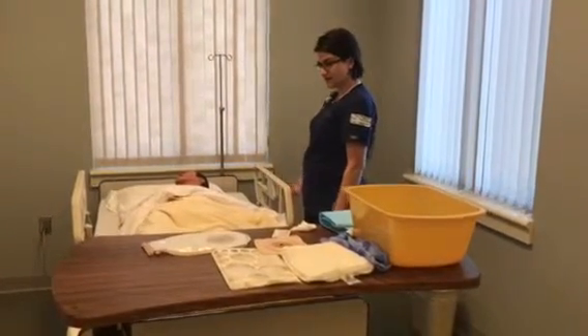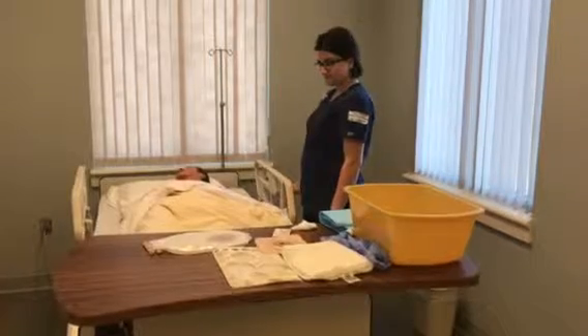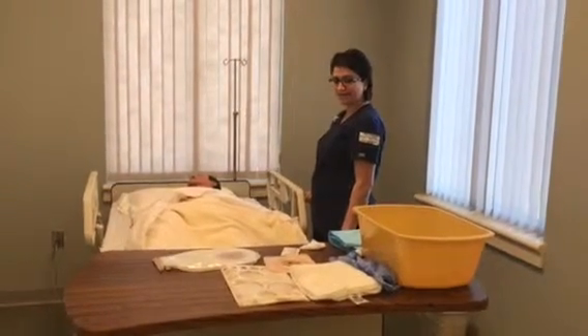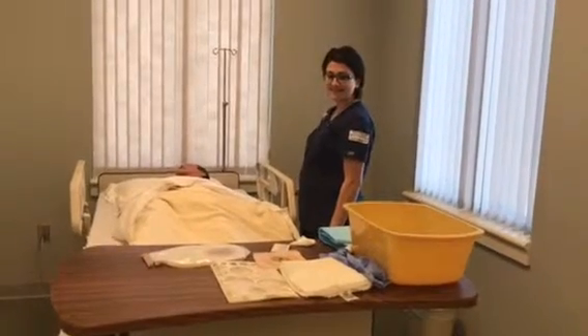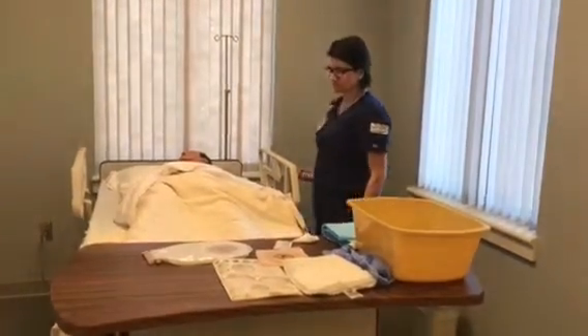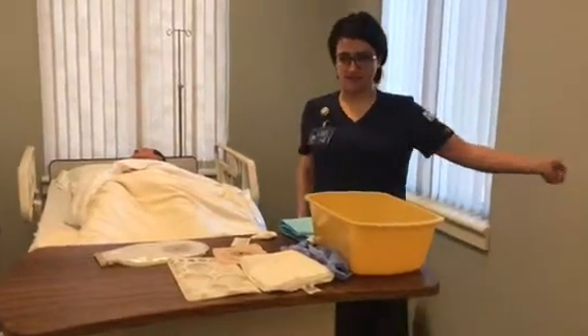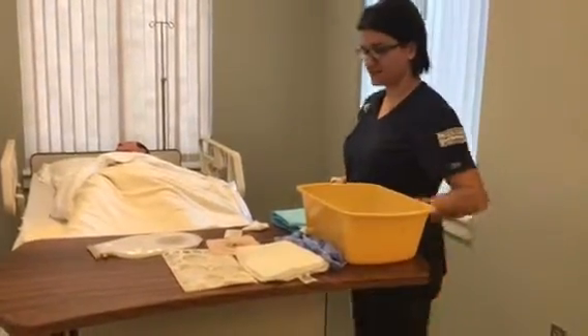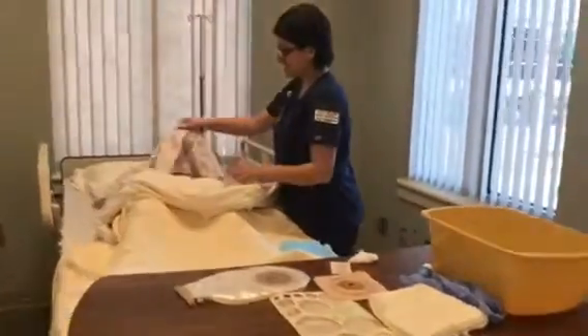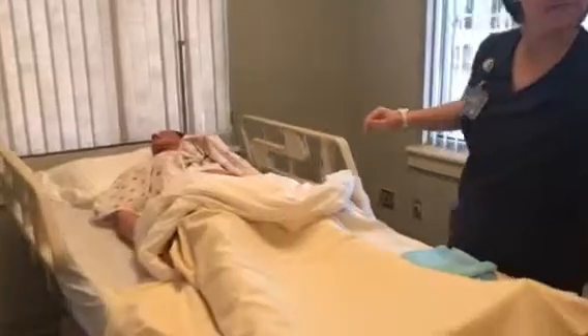I'm going to raise your bed. And I'm going to close the curtain, and the door is shut. I'm going to open up here and open up my supplies.